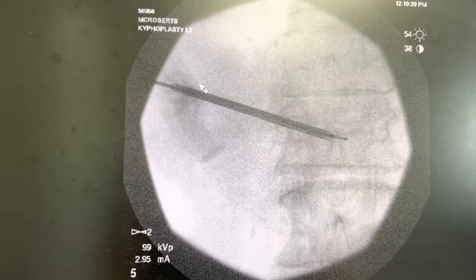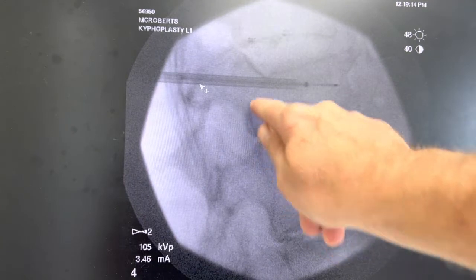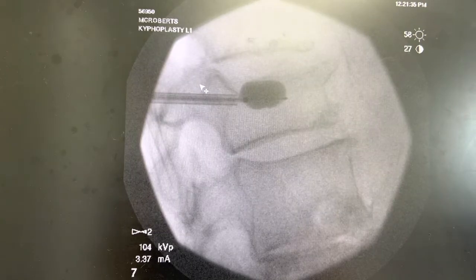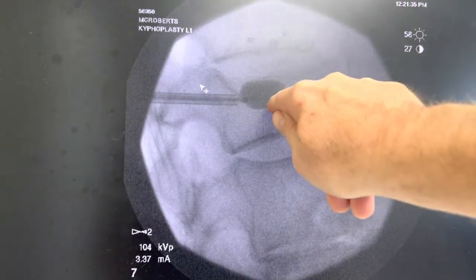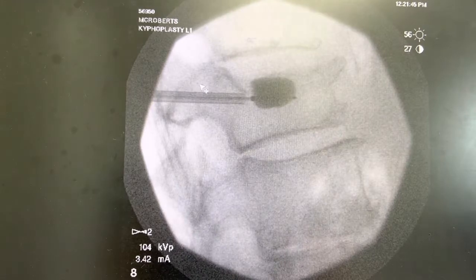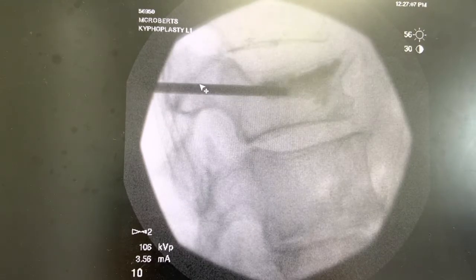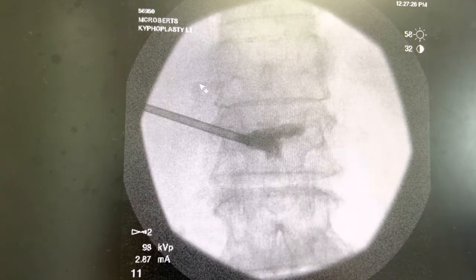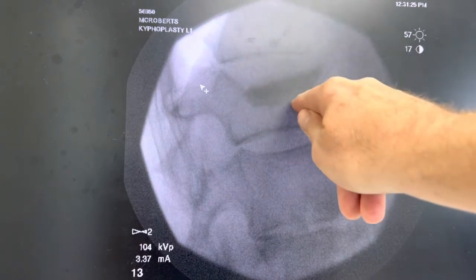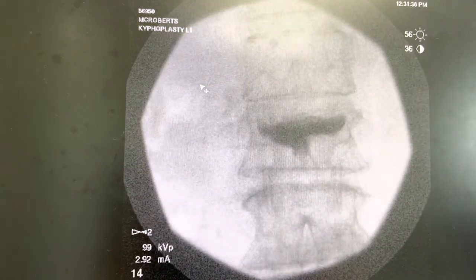And now you can see from what we call the AP view that we're just across the midline, right in the middle of the fracture. And if you go back you can see we're right towards the front of the body. So the fracture is right in here. Then we pull it back a little bit and we start inflating. We've already inflated up in here, and so now we're pushing the roof of the L1 vertebral end plate up and extending it. And then we start filling the cement from the front to the back. You can see this gray filling in the fracture site. You can see it crossing now from the AP — this is the left and right — and it's filling in that fracture area. Now this is what we have filled — the entire level of the fracture all the way into the base of it and all the way across from left and right. And that's the finished product.